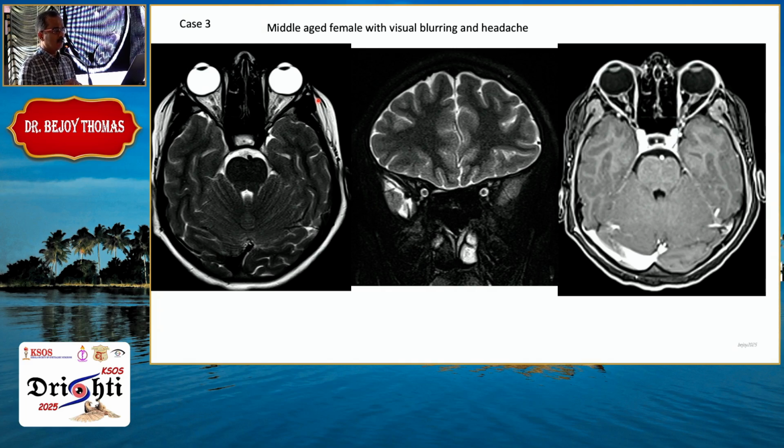In the era of very affordable cost of MRI, I think there is no role for CT scans except in trauma, or when there is a contraindication for MRI, or when we are suspecting an intraocular, intraorbital or intracranial foreign body. Most of the time CT is only adding radiation to the lens as well as the brain. Especially in children, you should avoid this, and avoid probably getting future patients for yourself by inducing radiation-induced cataract as well.